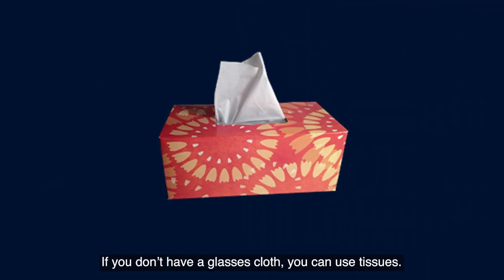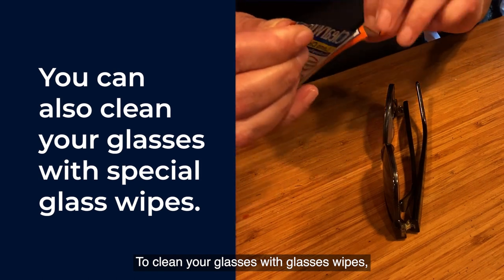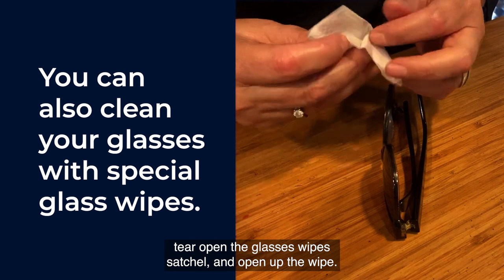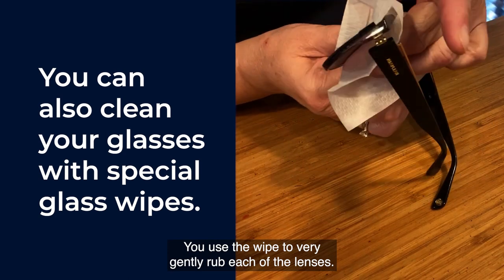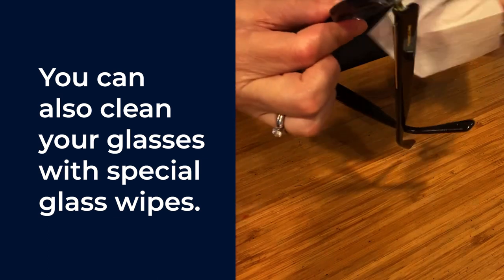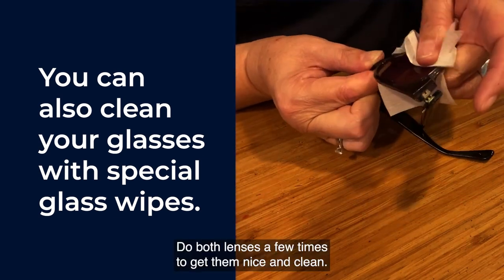If you don't have a glasses cloth, you can use tissues. To clean your glasses with glasses wipes, tear open the glasses wipe satchel and open up the wipe. Use the wipe to very gently rub each of the lenses. Do both lenses a few times to get them nice and clean.